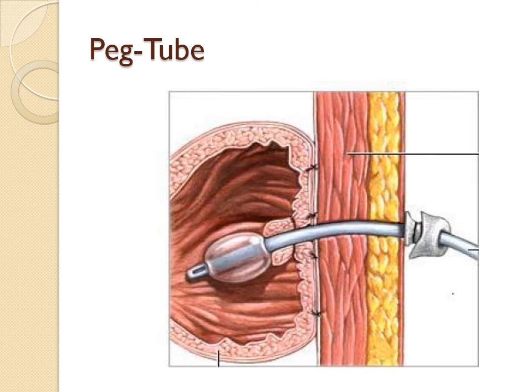and then document the entire procedure and how they tolerated it. Now, just to talk a little bit further about a PEG tube, as you can see on this slide, and a little bit about enteral feedings. Remember, when you have a patient, as I said, that is in danger of aspiration, the NG tube is usually going to be temporary until the doctor has decided that it needs to be removed and they need a permanent feeding.